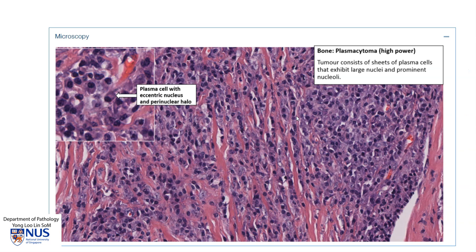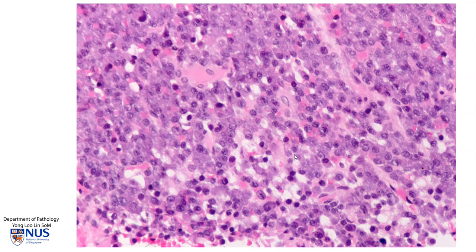Here is an example of the microscopic features, which show sheets of plasma cells. In this particular case, the plasma cells are quite mature, so they very closely resemble normal plasma cells. Here is another example of a different case where you can see a greater degree of cytologic atypia — in some areas, these plasma cells have relatively large nuclei and prominent nucleoli, as you can see here, as well as here.